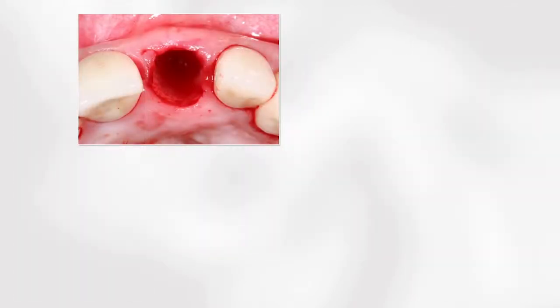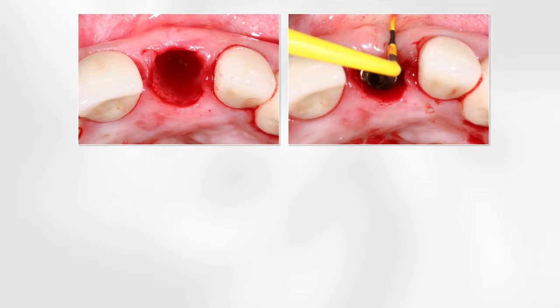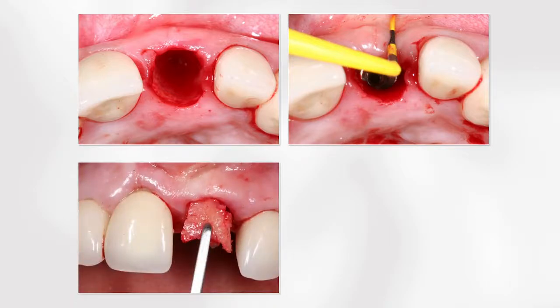And we decided to start with the left side. The tooth was extracted, applying a minimally invasive procedure. The implant was placed in the palatal wall. It was confirmed the buccal bone wall loss. After the graft was harvested from the left tuberosity, it was reshaped according to the defect configuration, and we also matched the cervical portion of the graft with the outline of the gingival margin because our goal here is to restore the bone architecture. This is the main goal of the IDR procedure.